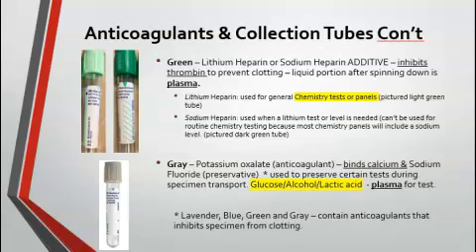The lithium heparin can be used for general chemistry panels for a patient, but if a lithium test is ordered for a patient, you cannot use a lithium heparin tube to perform that test because the lithium in the tube will throw that result off. If a lithium test is ordered in clinical chemistry, you could use a sodium heparin tube or you could use a plain red top tube because it wouldn't have that additive of the lithium to throw the test result off for the patient.